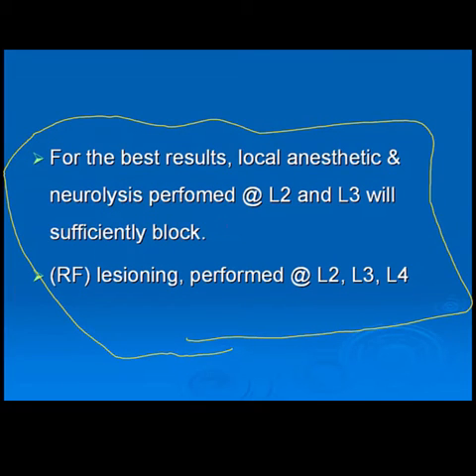Once you reach the anterolateral aspect of the vertebral body, we put just 0.5 ml to 1 ml of contrast to make sure that you're outside the psoas muscle and you are not inside a blood vessel, and there is no backward flow into the intervertebral foramen.